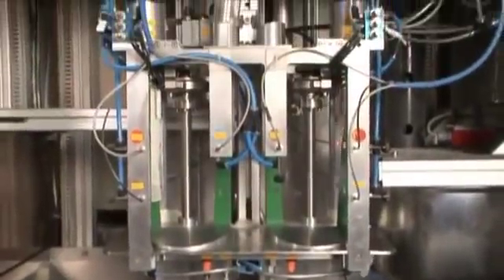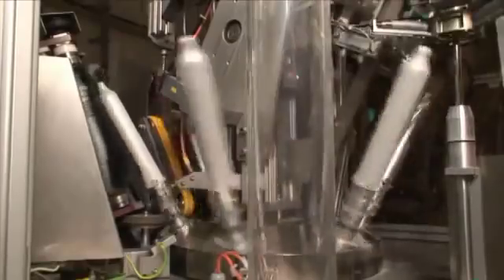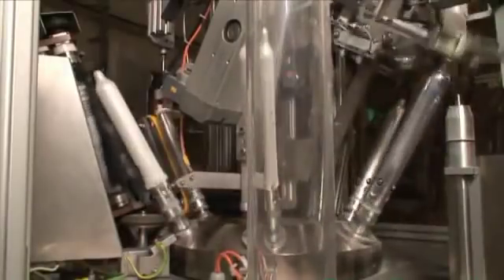Next, they are subjected to electronic tests. This is the test during which a high voltage is applied between metal forms and rotating carbon fiber. If any voltage passes through an otherwise insulating condom, this condom is faulty and will be rejected immediately. This pinhole test makes sure that all condoms produced are 100% pinhole free.